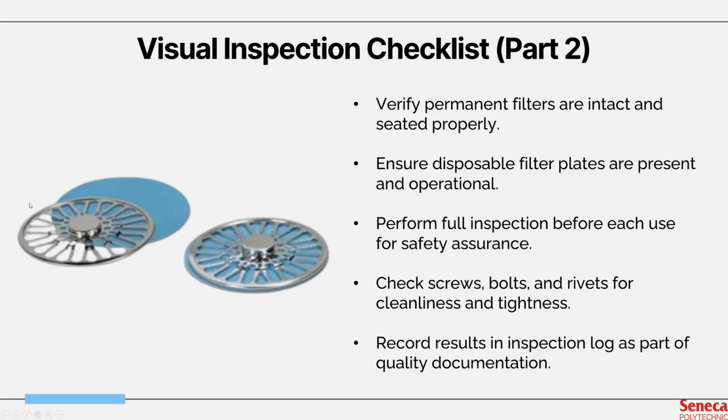Very commonly, we've received complaints from the OR. In some situations, they find that when they open a sterile container, the filter housing actually fell off along with the filter, which makes the instrument set contaminated.